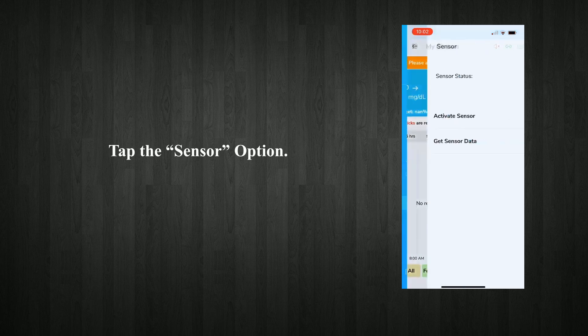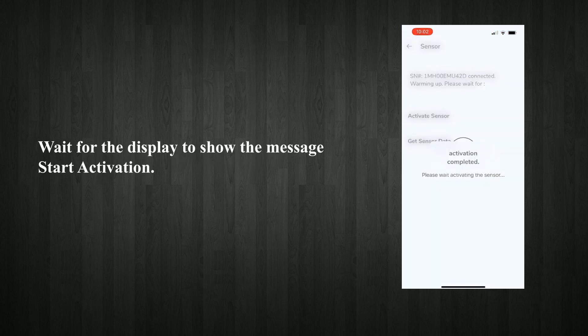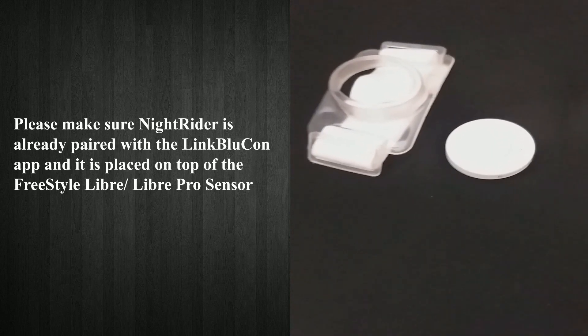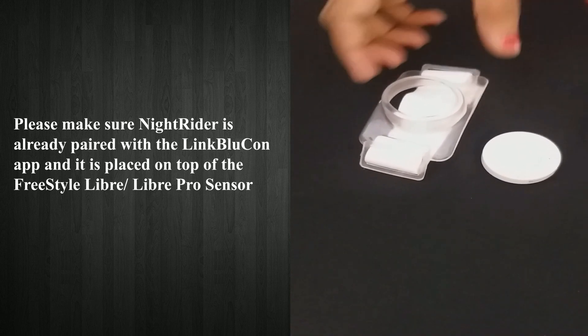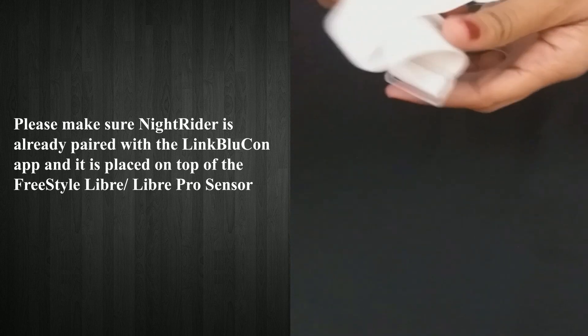Tap the sensor option. Tap on the activate button. Wait for the display to show the message 'start activation.' Now the sensor is activated — wait about an hour to get readings; normally you start getting readings before one hour. Please make sure Nitrider is already paired with the LinkBlucon app and is placed on top of the Freestyle Libre or Libre Pro sensor.